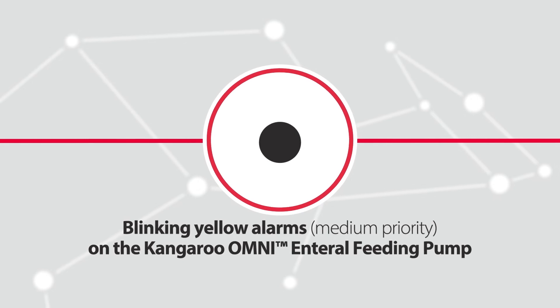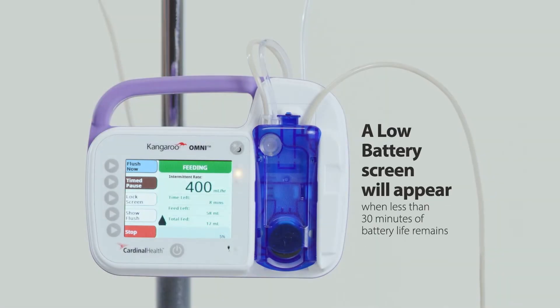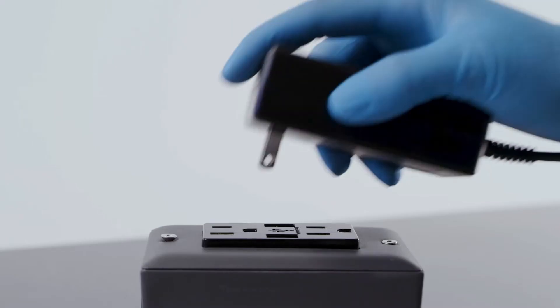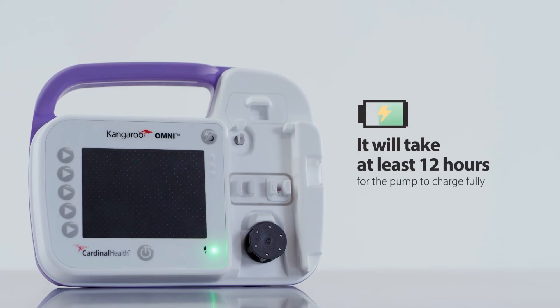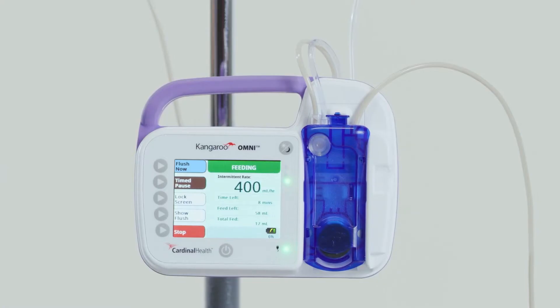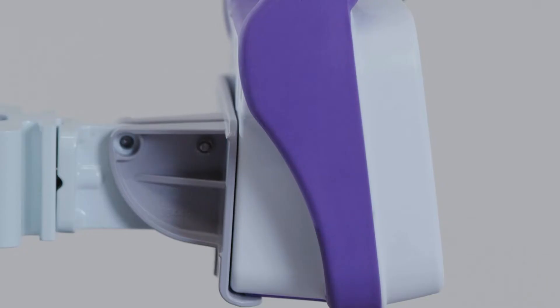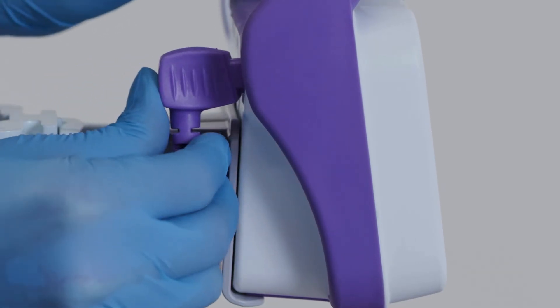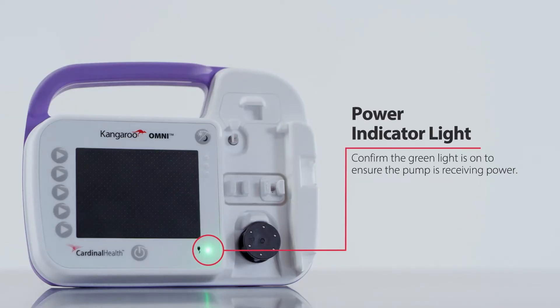Low battery alarm: a low battery screen will appear when less than 30 minutes of battery life remains. To resolve the alarm, plug the pump into an electrical outlet. The Kangaroo Omni enteral feeding pump will continue to return to the screen that was active prior to the error and will continue to operate normally. If this alarm occurs while the pump is plugged in, ensure the power adapter plug is completely inserted into the power adapter port on the back of the pump and that the green power LED on the front is illuminated.